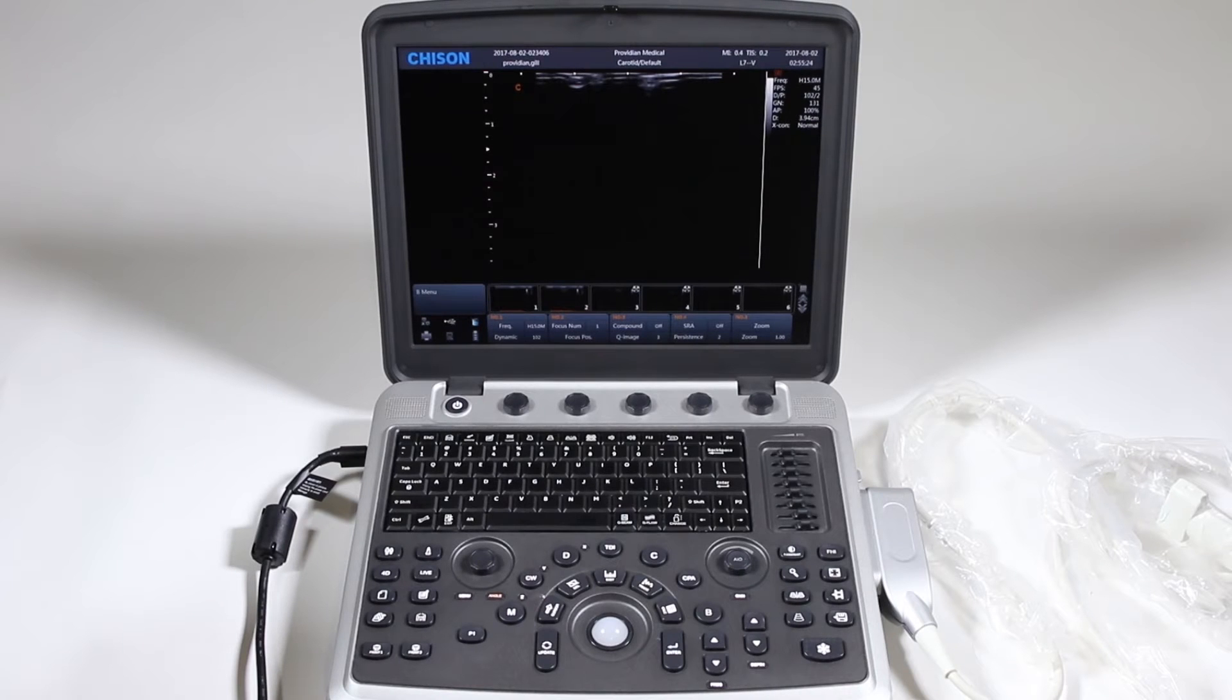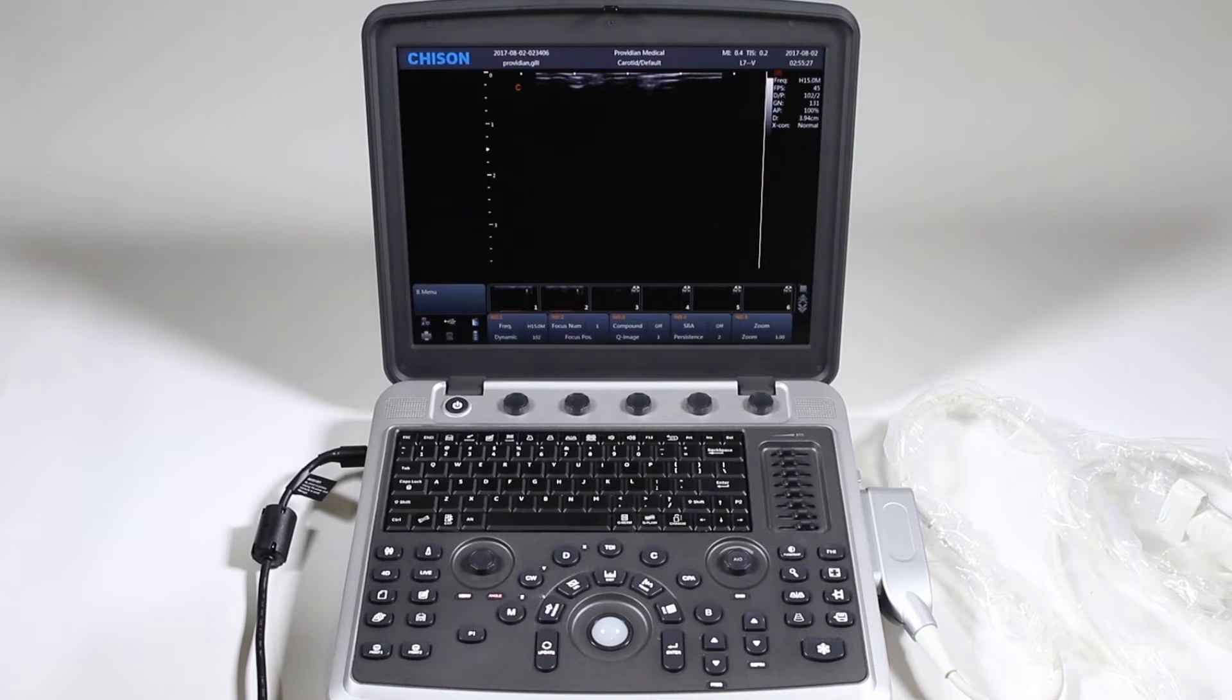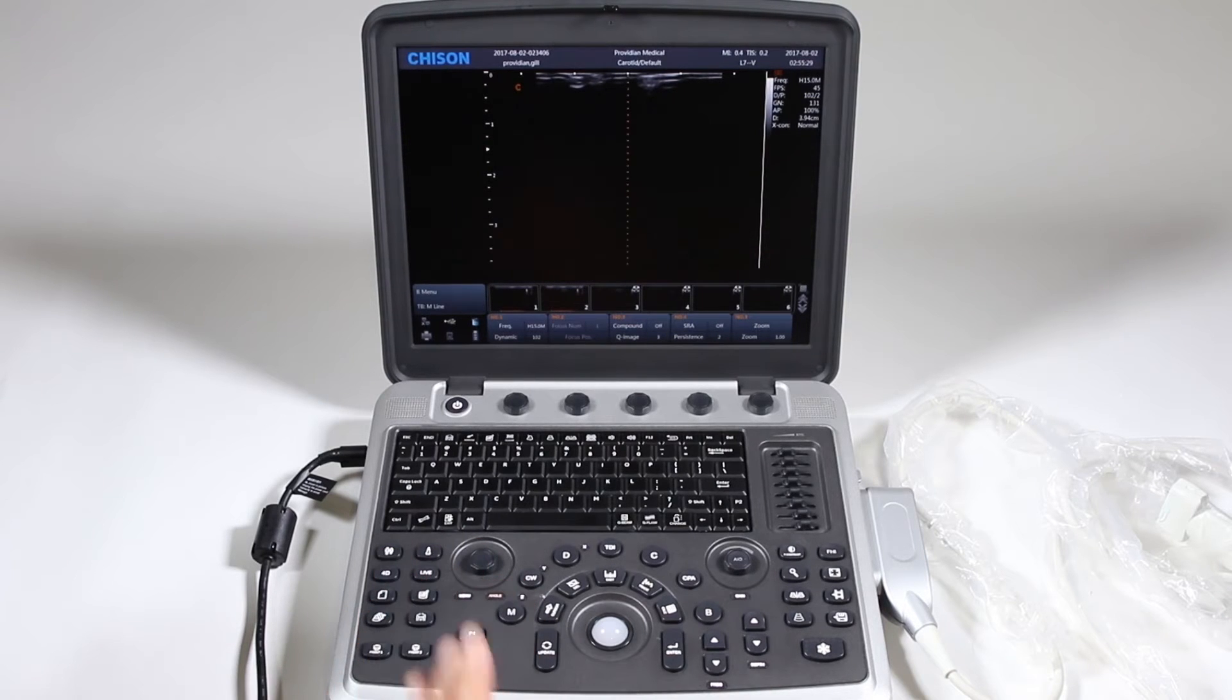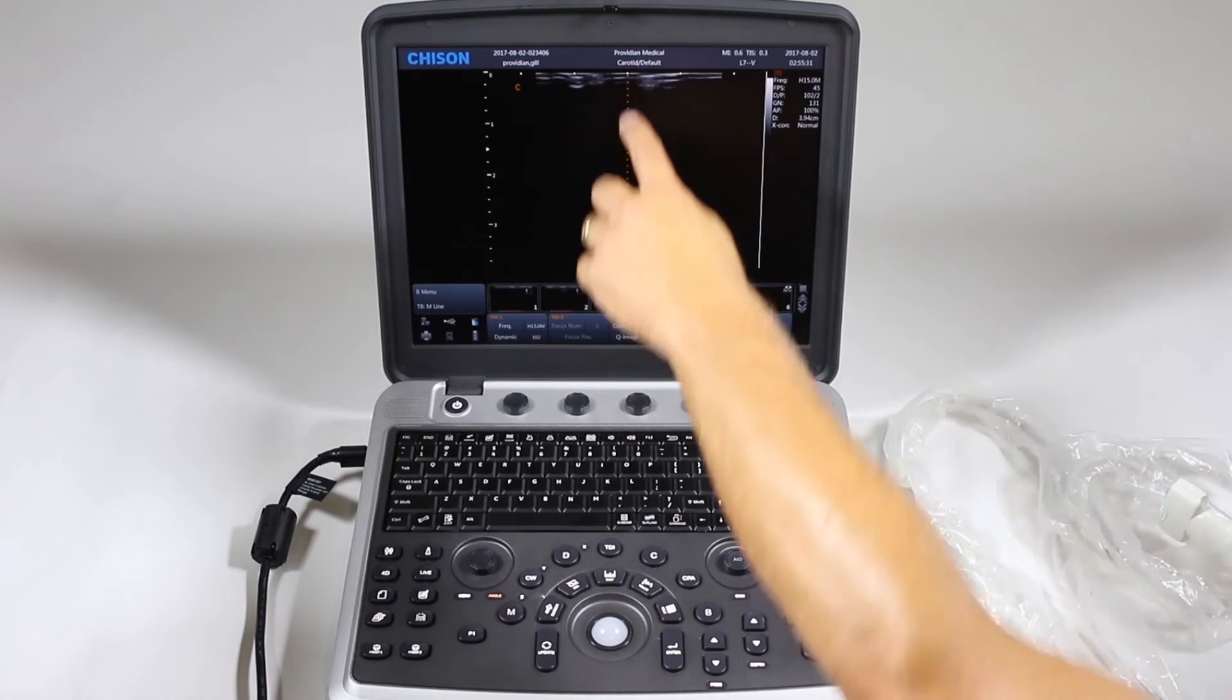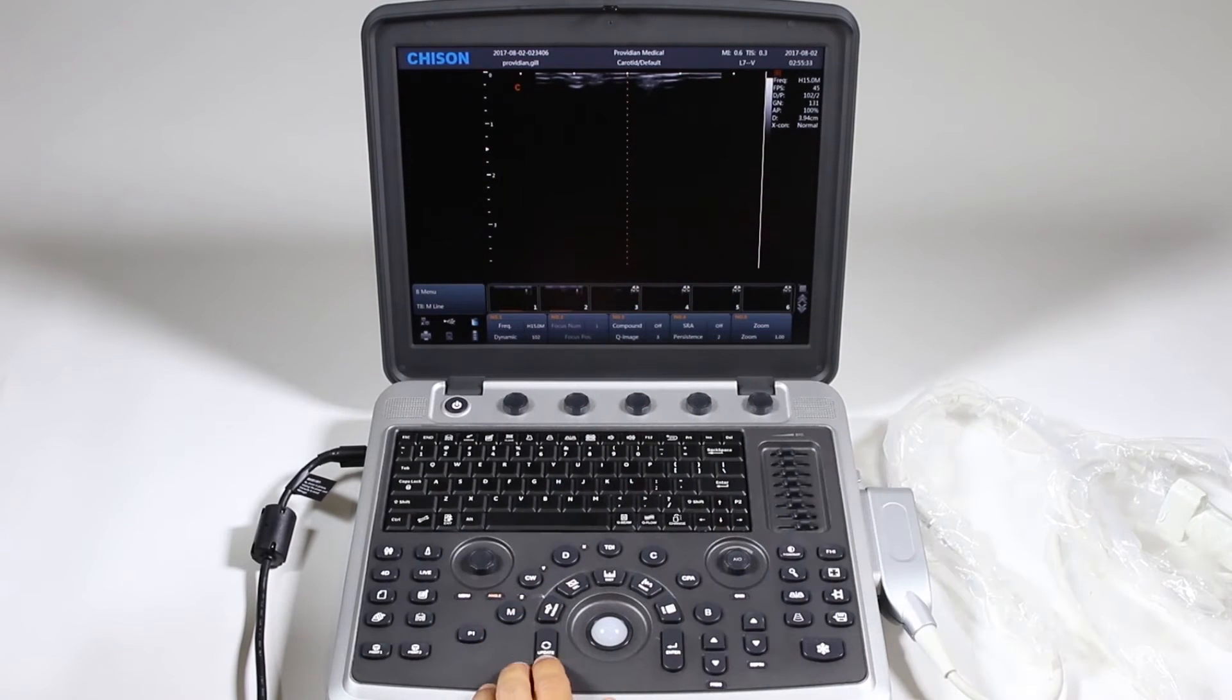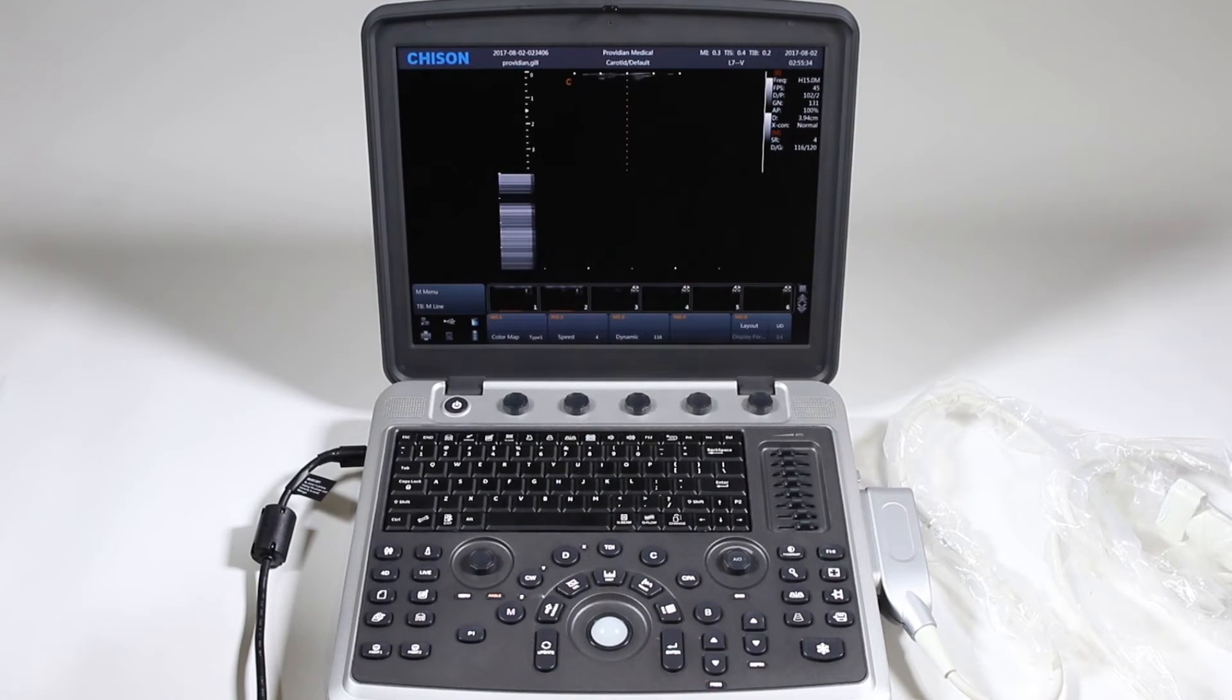Now we'll get into M mode and Doppler modes. To get into any imaging mode, you'll just start by pressing that mode and you'll get your reference line here. Simply click update and you'll have it there.